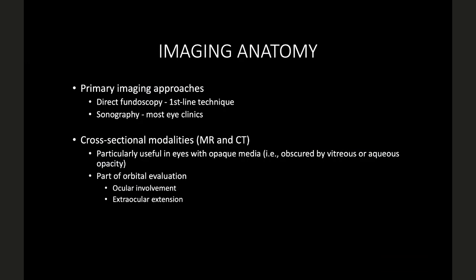If I want to see an orbital fracture or a skull fracture, would I get an MR or would I get a CT? I think bone is better, also better for CT. Perfect, right? Yes. So bone is better for CT, nail it in your head. Next time anybody asks you when you're sleeping, you're going to say CT. So if CT is for bone, then soft tissues are better in? MR. MR, right? Because brain and everything, you know how clarity is so good in MR.